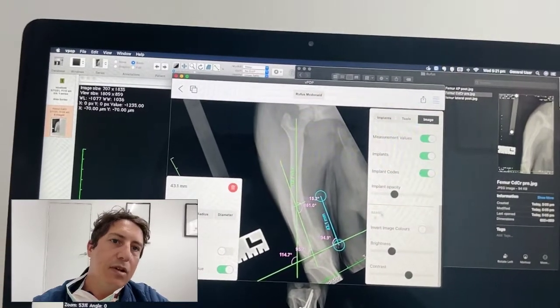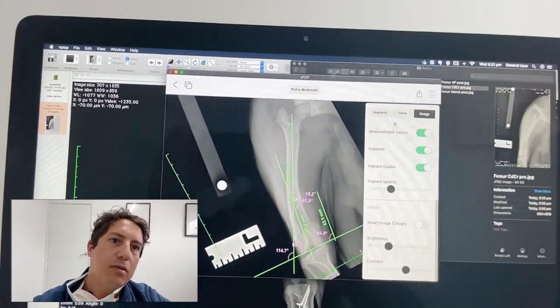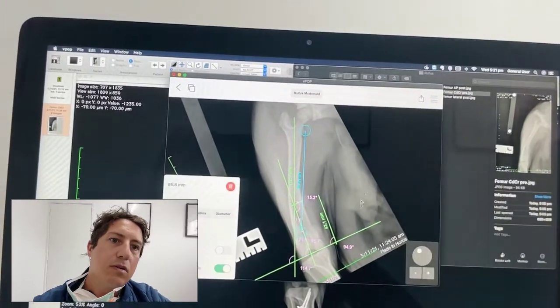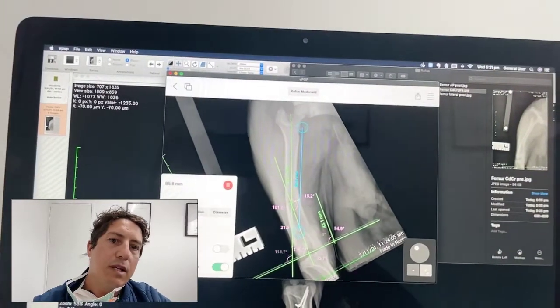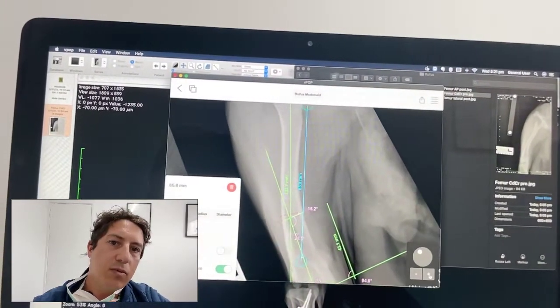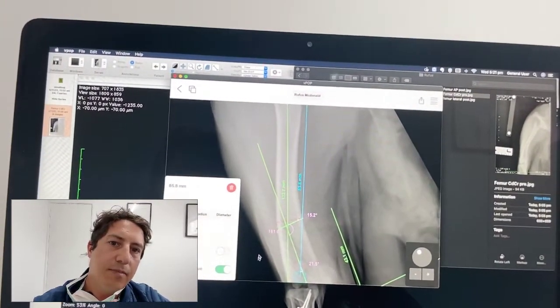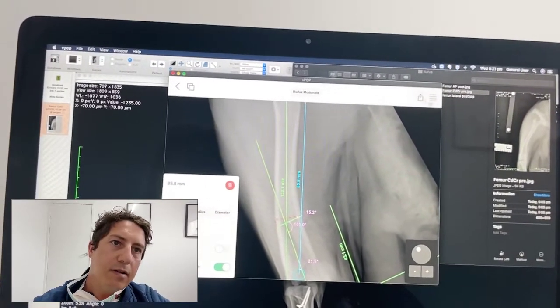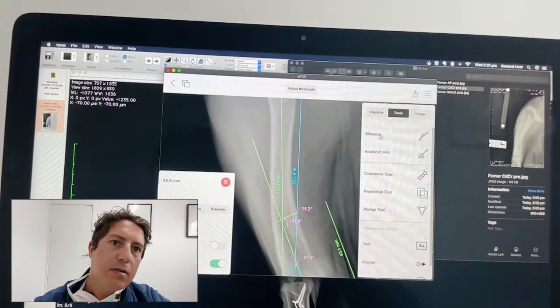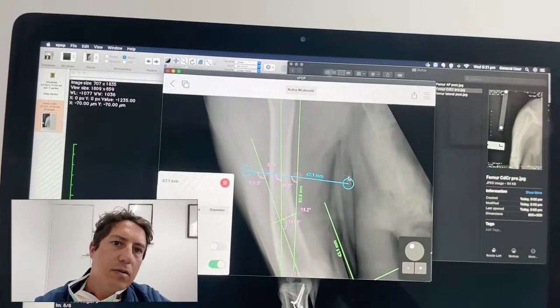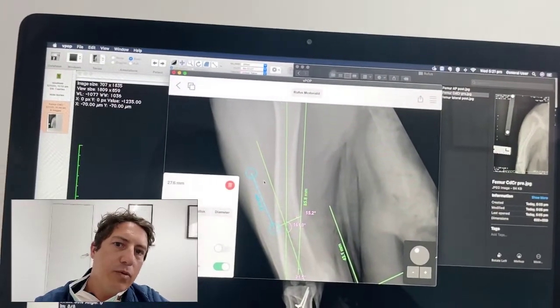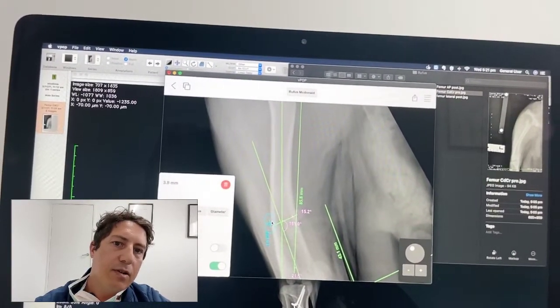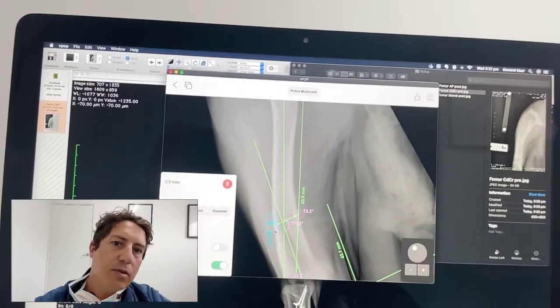If I zoom in here, we can work out how big this wedge wants to be — I can run a line down here and work out how big a wedge we wanted to take out. It's about three millimeters in this guy, so the wedge we want to take out was about three and a half millimeters.